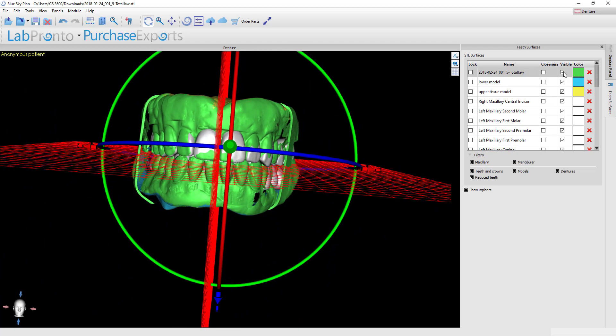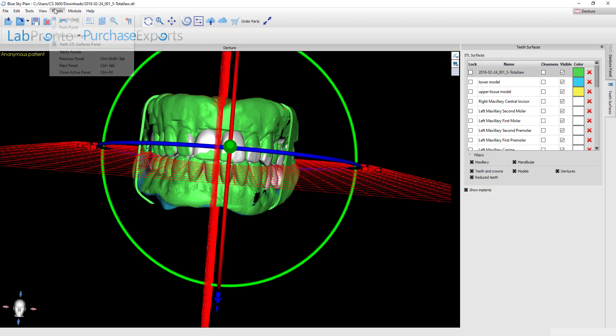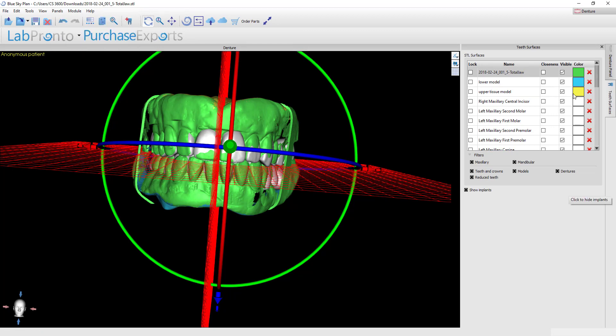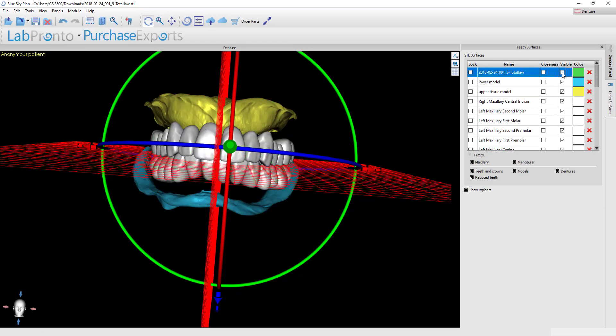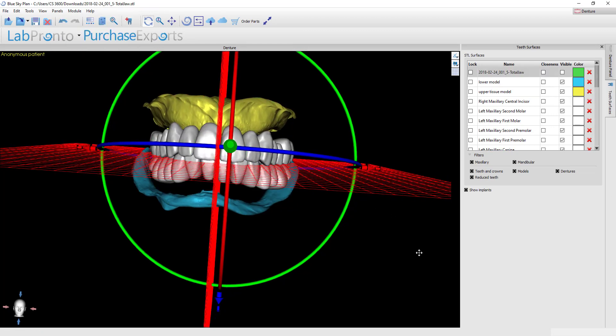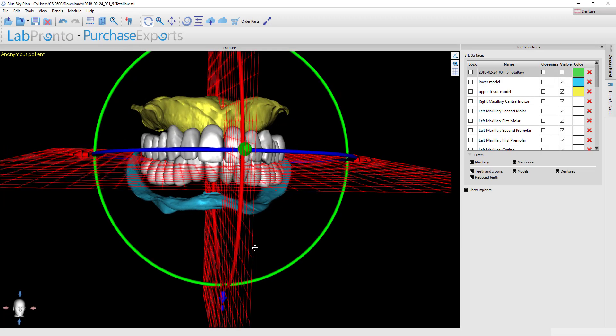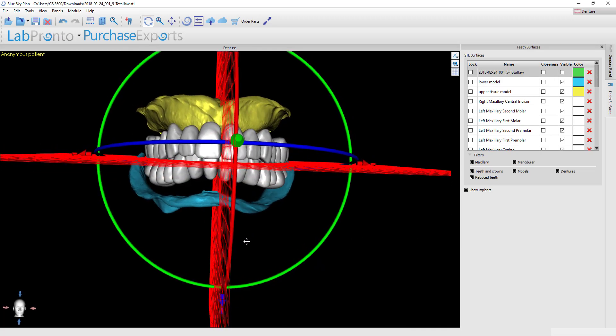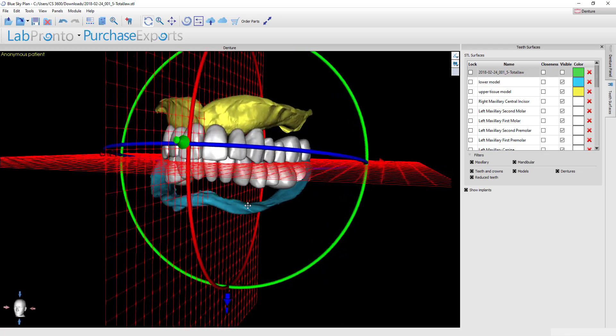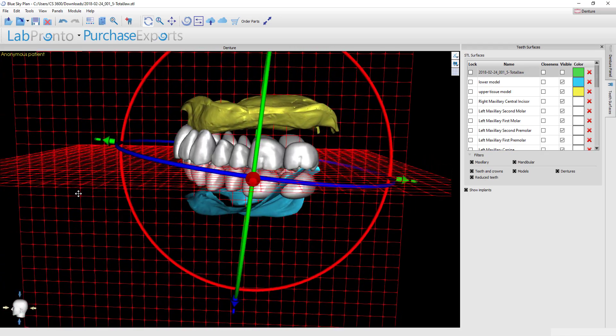You can always toggle on and off the visibility of the model. If you don't see this teeth surfaces panel, simply come up here to panels and choose teeth surfaces, and then you can just check on and off visible on the menu of the different STLs that you've got available.